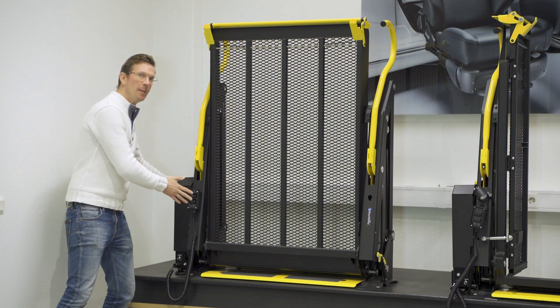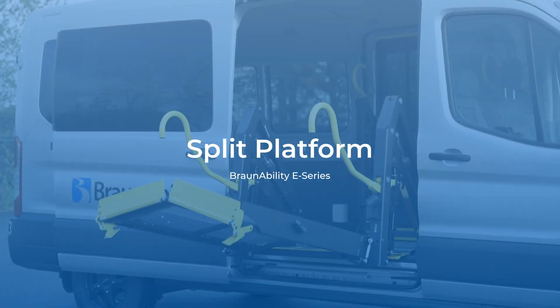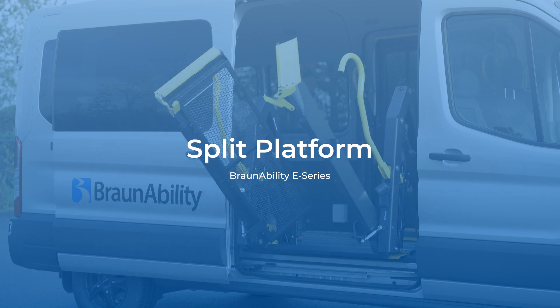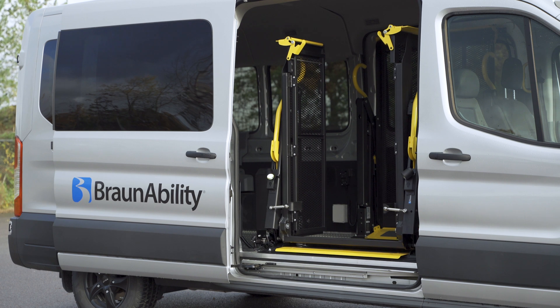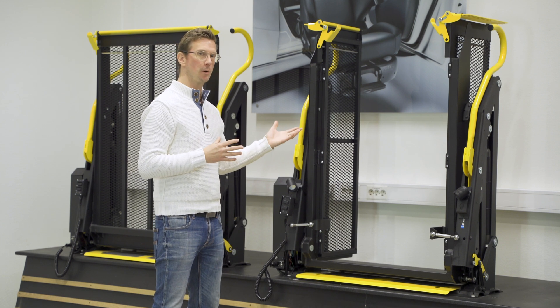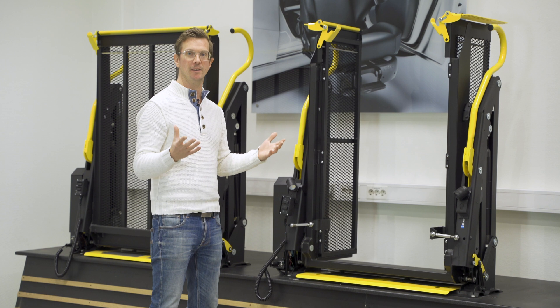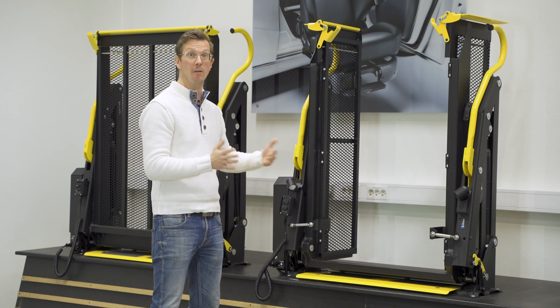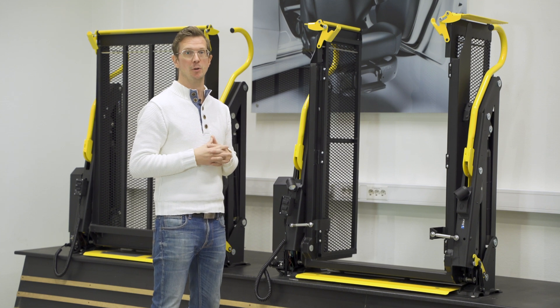Its relatively short depth leaves more room for seats inside the vehicle. The split platform stows by splitting down the middle, with each part folding up against the sides of the vehicle. In its stowed position, the lift is out of the way and out of sight. It won't block your view through the window and won't stop you from using the exit to load luggage or get in and out of the vehicle — for example, if you need to evacuate during an emergency situation.